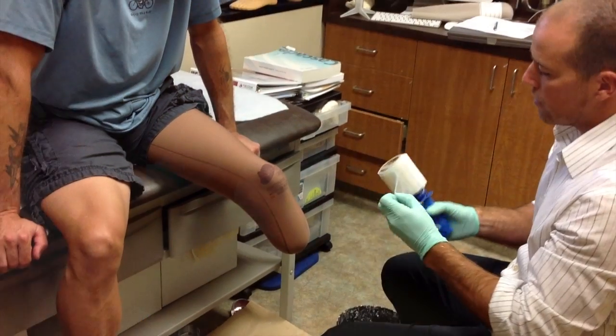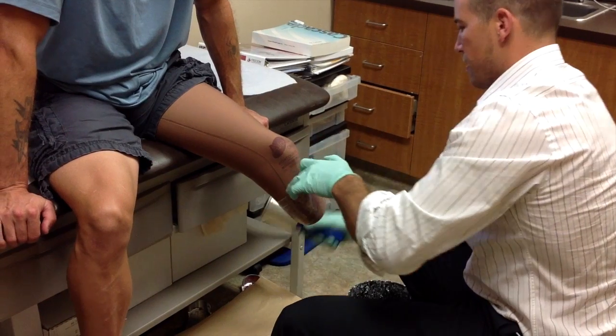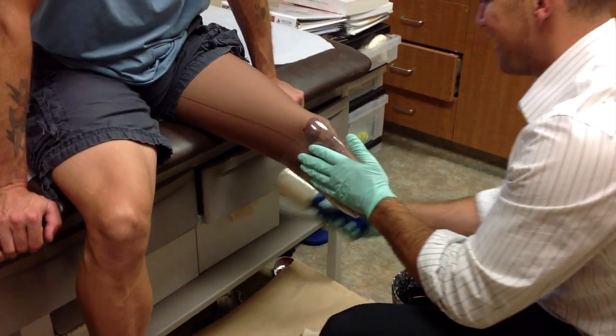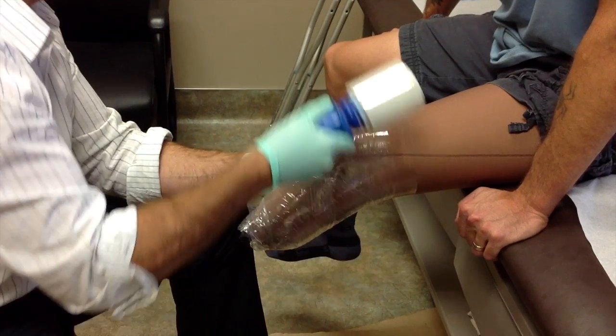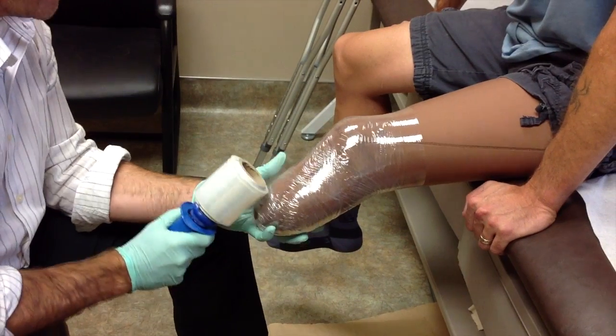The practitioner then applies a very thin layer of plastic all the way around the gel liner and around your limb. The purpose of the plastic is to keep the gel liner nice and clean during the casting procedure, as it can be quite messy. This also serves a purpose in compressing some of the soft tissue of your limb.